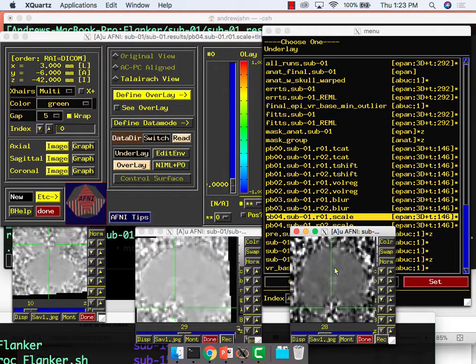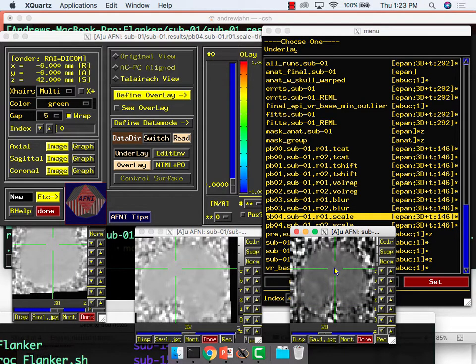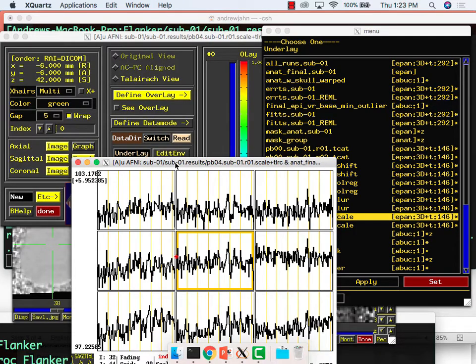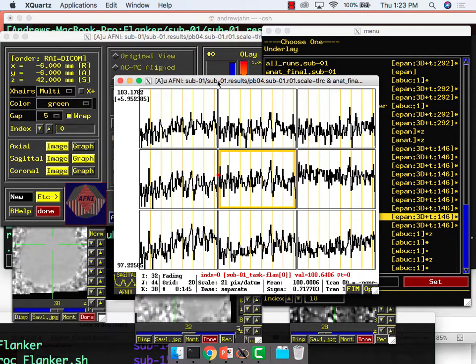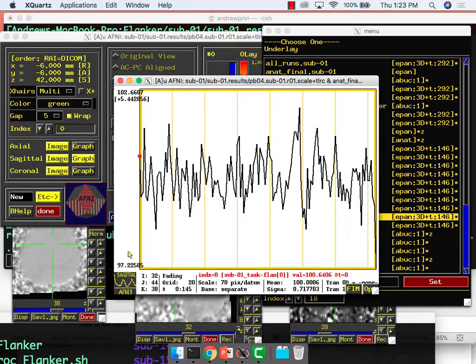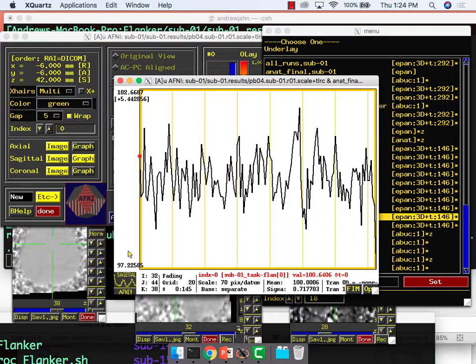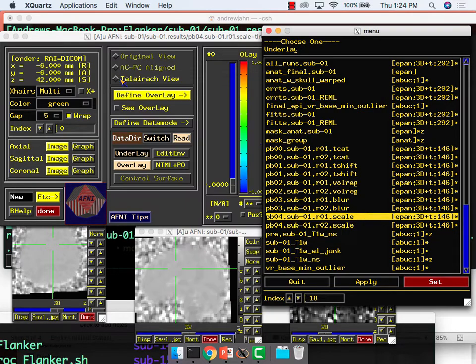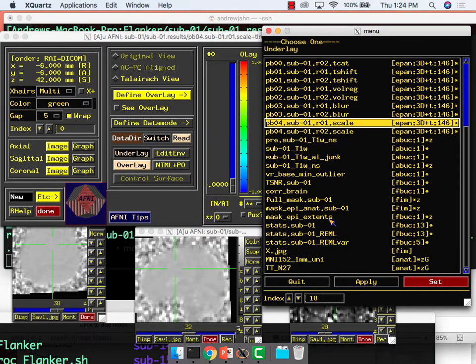As far as scale, there's nothing I really look for in terms of a quality check. It will look something like this, and the important thing is if you look at the scale of this time series. If you compare this to the original time series, the original time series, the signal values are more or less arbitrary. But what we've done in scaling is made the average of the entire time series to be 100. So you see here at least the bottom is 97, top is about 102, so it's now roughly showing deflections from 100. So that's really all that I'm looking for here.